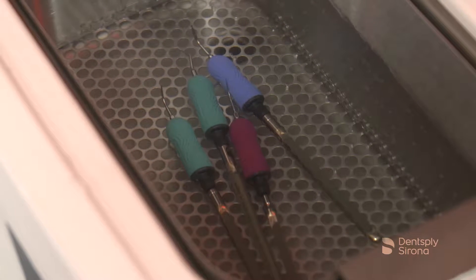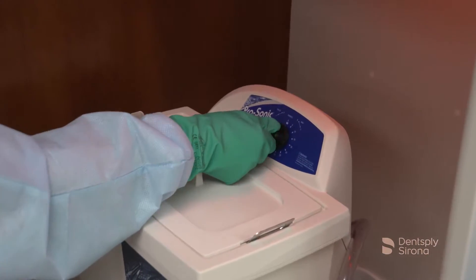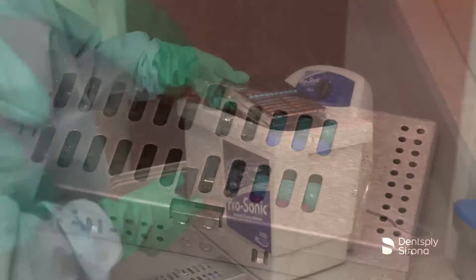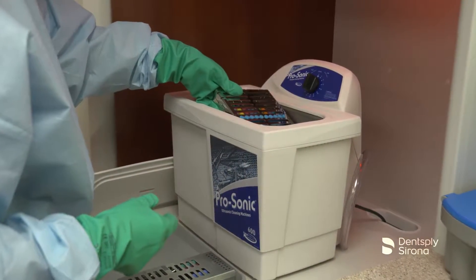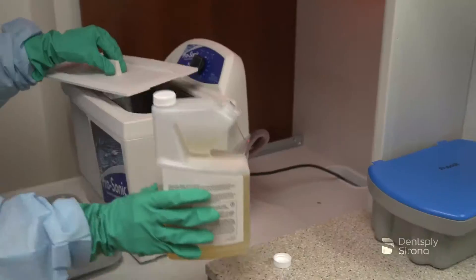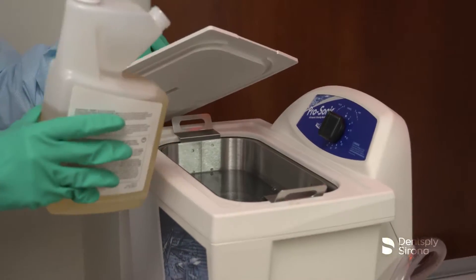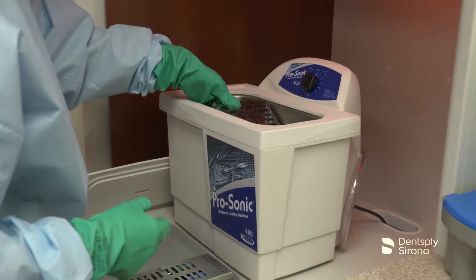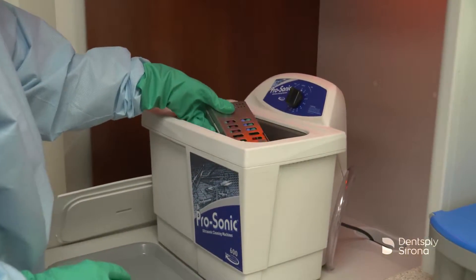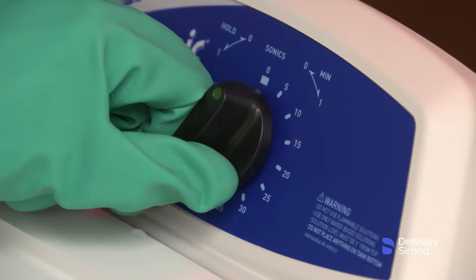Cavitron inserts should be placed in the ultrasonic bath basket separate from all other instruments to protect them from potential damage. Cavitron ultrasonic inserts may be cleaned using an ultrasonic water bath for up to 15 minutes. A pH neutral instrument cleaning solution, such as Resurge, is recommended for ultrasonic cleaning with Cavitron inserts. It is important to adhere to the ultrasonic cleaning bath manufacturer's recommended liquid level. Place the device into the ultrasonic bath, ensure that the instruments are sufficiently covered, place the cover, and set the unit for the indicated contact time.